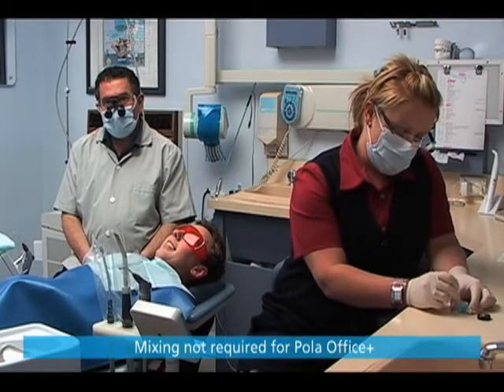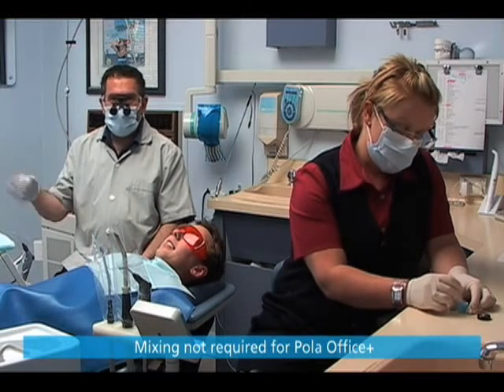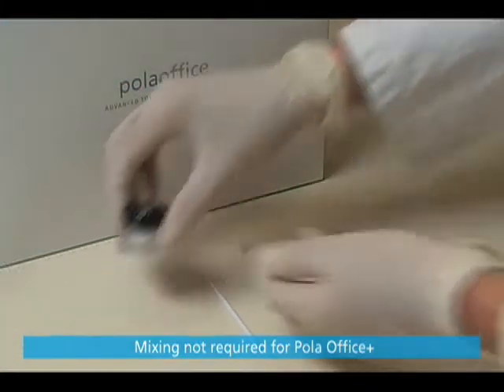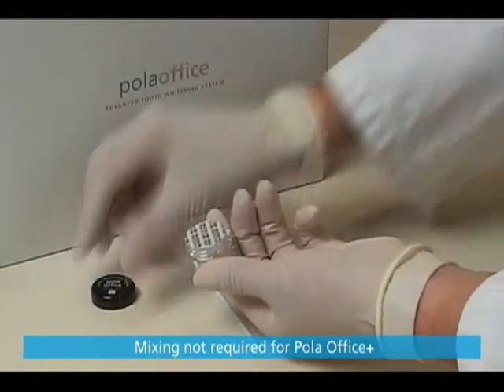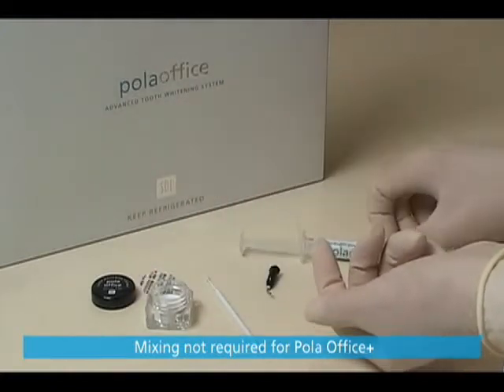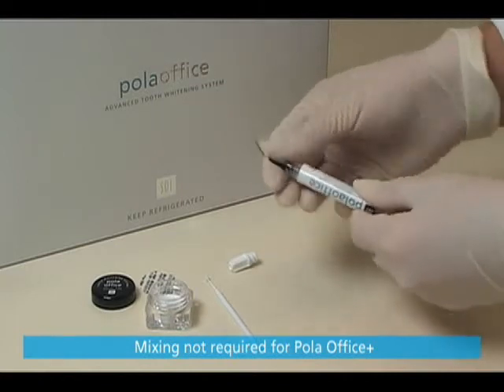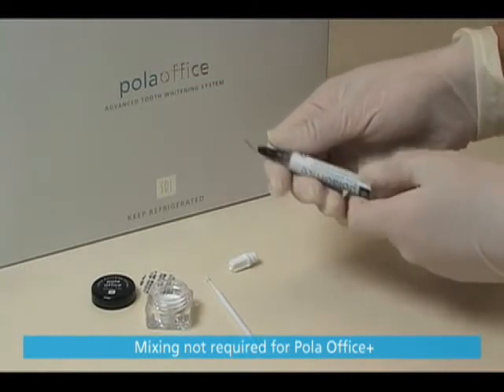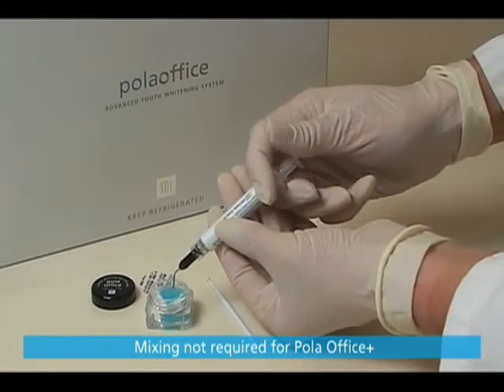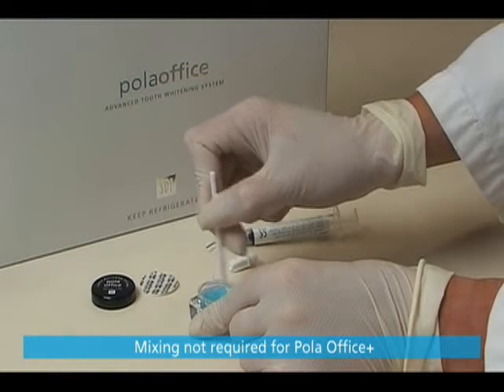Once mixed, Polar Office gel is effective for 20 minutes. Therefore, it is important that the liquid and powder are mixed just prior to being applied to the teeth, away from the patient. Have a timer ready. Open the powder pot. Take one Polar Office syringe and firmly attach a tip. Carefully pull back the syringe plunger to release pressure. Carefully extrude the contents of the syringe into the pot. Immediately mix using the brush applicator until the gel is homogenous and bright blue in color.